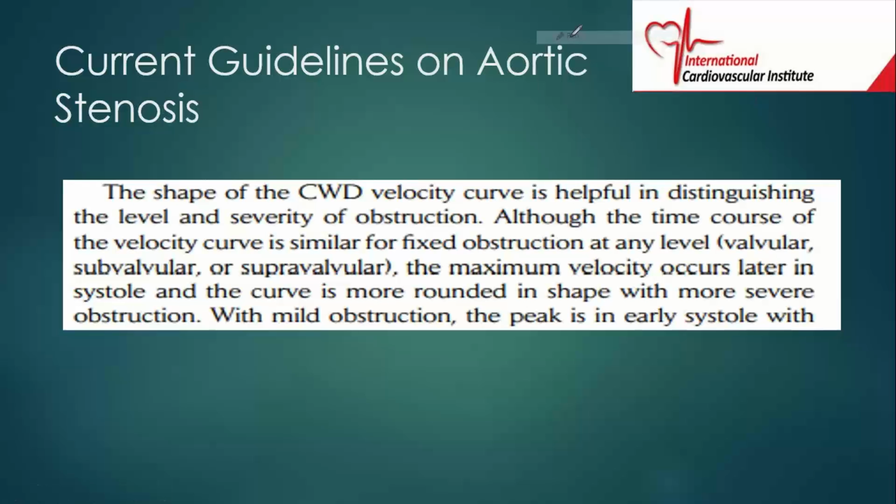If the stenosis is not very severe, then you're going to get an early peak. It probably looks something like this. The peak comes early. If the peak comes early, it's more than likely not a severe obstruction.